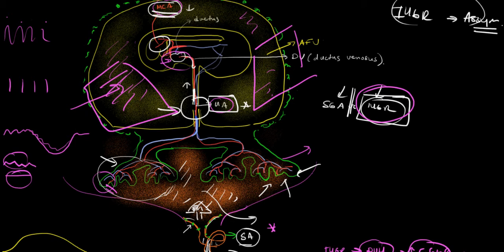And when the baby moves, something great happens. Just like when I start to run, if I do exercise, my heart rate goes up. And that's a sign of good health. So they stopped doing the contraction stress test looking for the decels, and they just started watching babies and hoping that they move, and coupling it with ultrasound to see if they move, and looking for accelerations, and that became, you guessed it, the non-stress test.